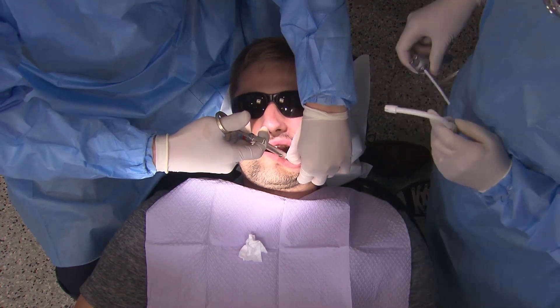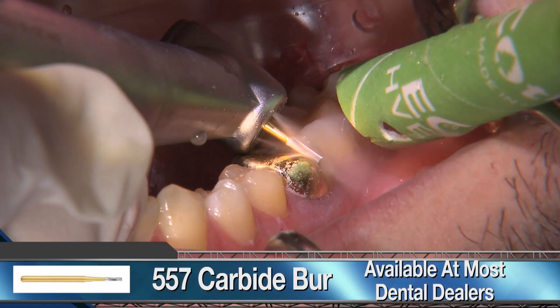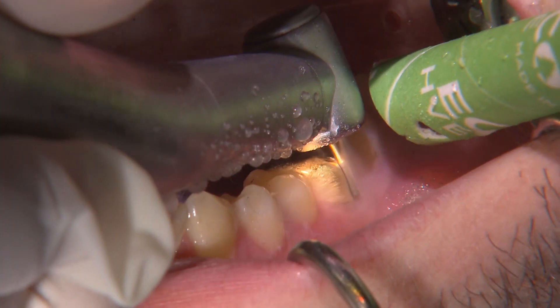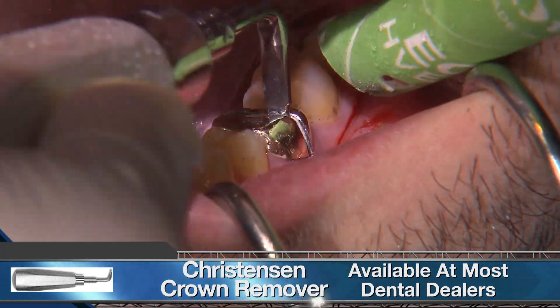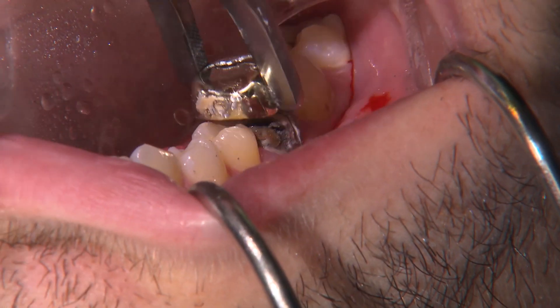Since the tooth is endodontically treated, I only administer local infiltration for gingival pain control. I begin the removal of the old crown with a 557 carbide to section through the buccal and occlusal. Once I can visualize the prep, I use a 90-degree Christensen crown remover to break the seal between the crown and tooth, and wiggle the crown off using crown removal forceps.